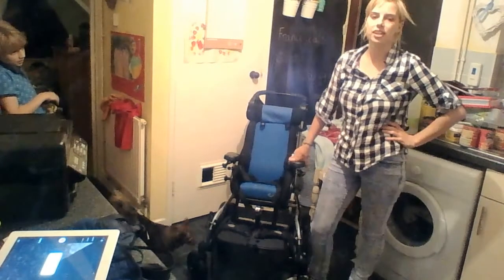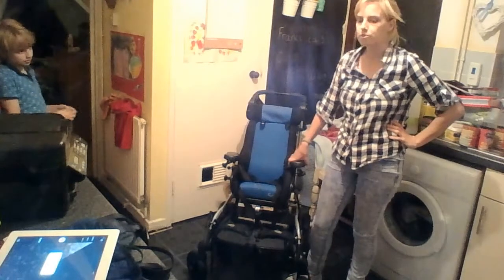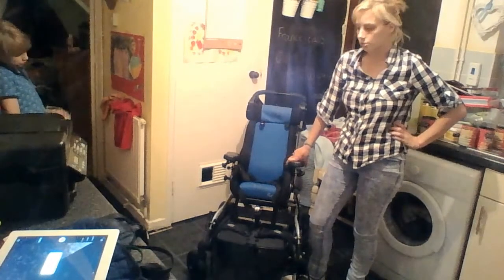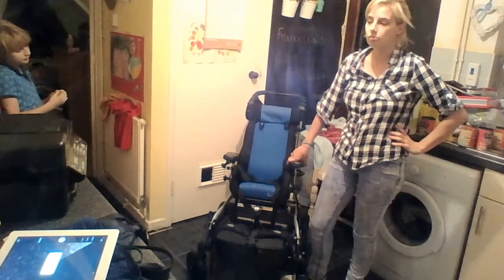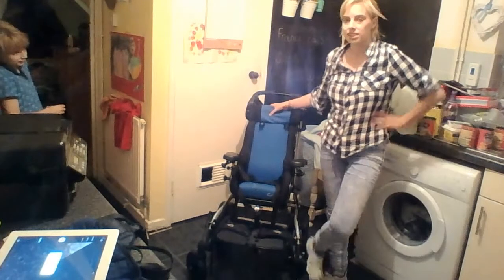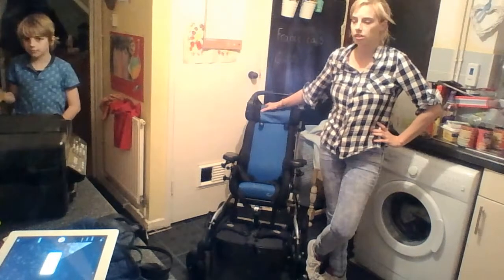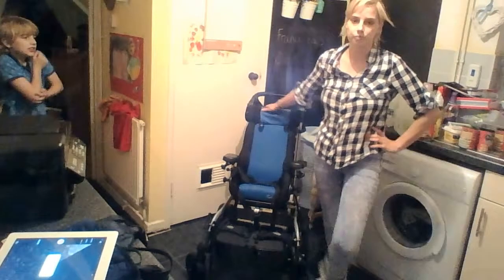Other than that, we absolutely love this chair — we won't change it. This is brilliant, it is sturdy. This chair has been pushed around, we've been on country walks, we've been to the beach, we've been everywhere, and it's lasted — I think we've had it two and a half years now. It is a really, really good chair and I absolutely love it and I can't recommend it enough. Any questions just leave them below and I will get back to you. Bye!